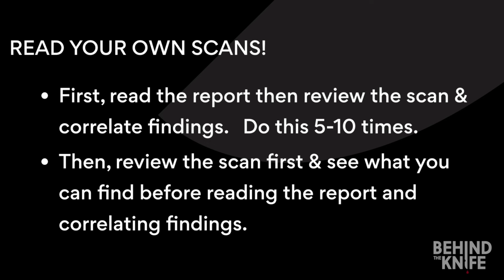Now, to get started, try reading the radiology report first. Then go to the scan and see if you can match up the findings. Once you've done that a handful of times, we recommend looking at the scans first, then seeing what you can find, and then checking the radiology report. If you do this enough times, your pattern recognition will definitely improve, and you too will be reading CT scans with the best of them.